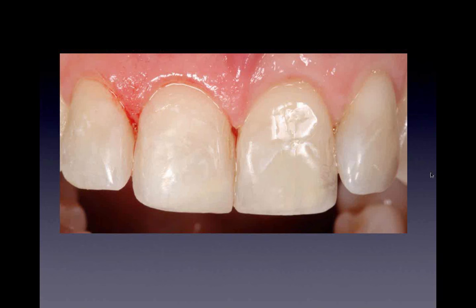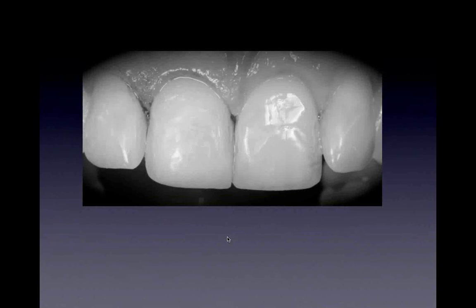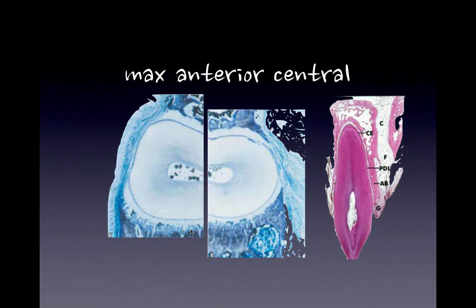Let's answer some more questions. And that's the black and white. The black and white shows you the contour and the texture. So whenever I switch to black and white, I like to see the contour and the texture of it and see did I get it right. And that's a great thing about digital photography. You really get a good sense of what you're doing with the colors.